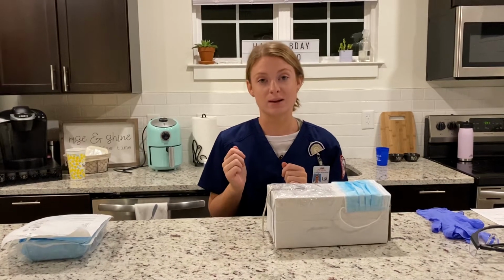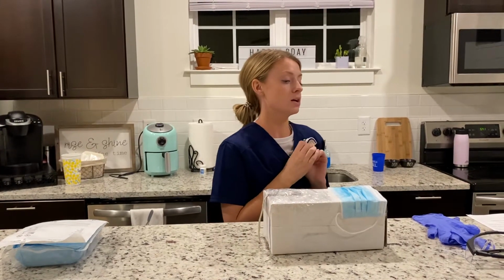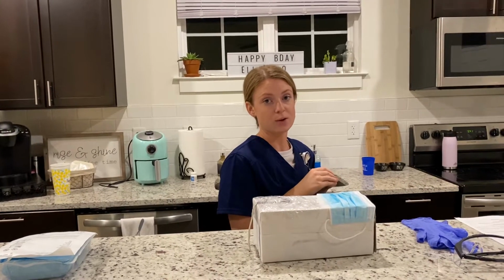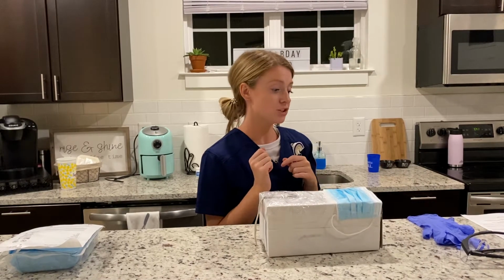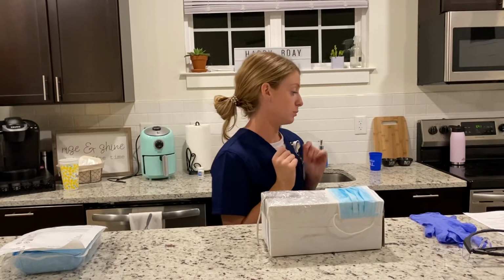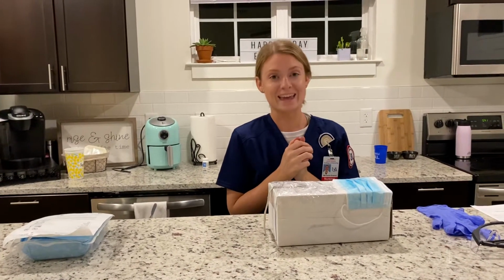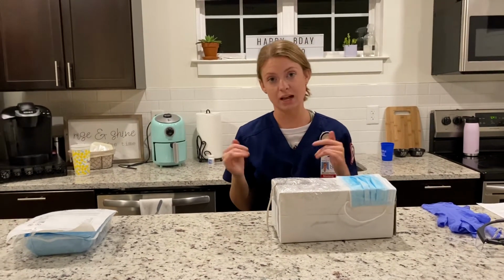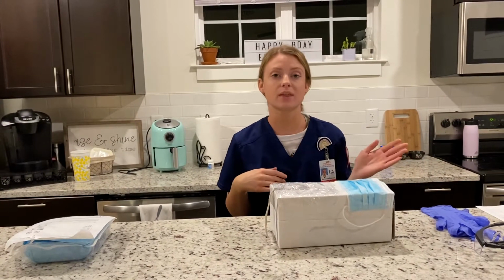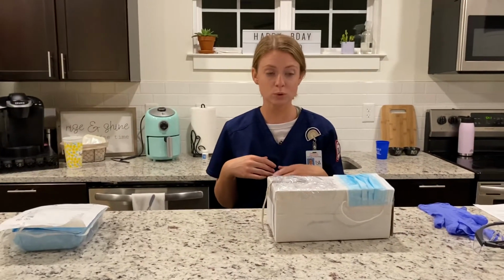So now I would make sure that the bedside table was placed next to me, and I would want to make sure that it was at a working height to avoid contamination. And then I would position the trash can and provide hand hygiene. And then I am going to raise the bed to a working height and lower the side rails, and I would make sure that the head of the bed was slightly elevated and the patient was comfortable.